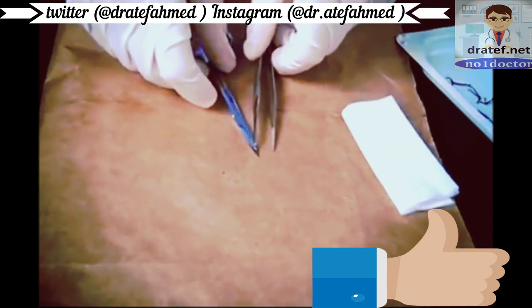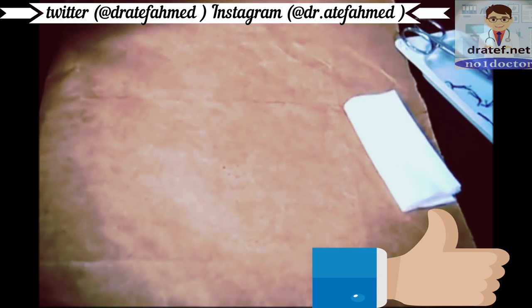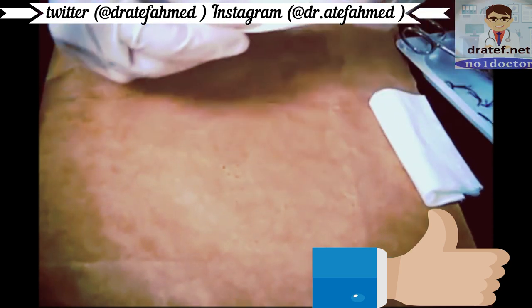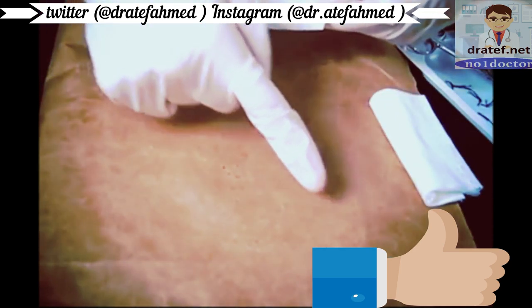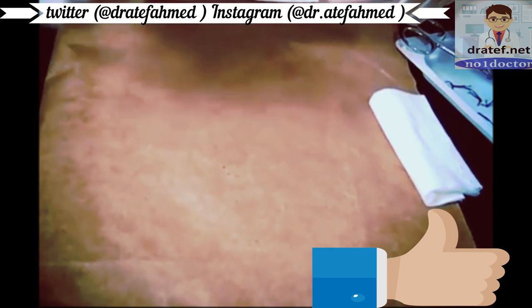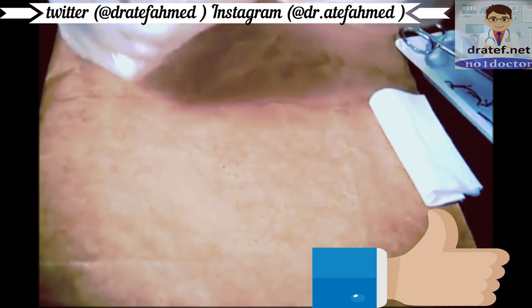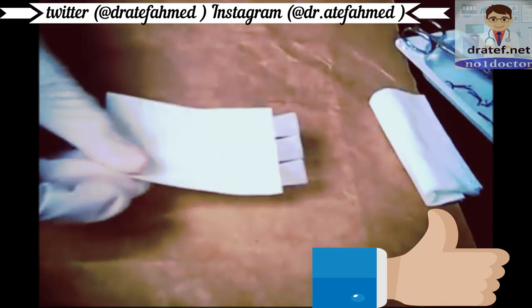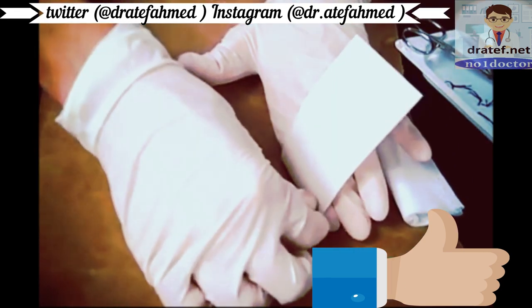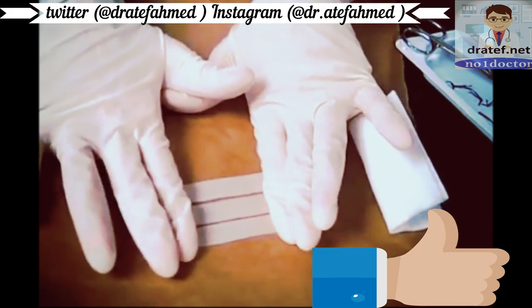That's it. After this, whatever the doctor orders — they usually order SteriStrips. Get your SteriStrips and I like to put skin prep around the outside; it looks like an alcohol swab and that just makes the strip stay a little bit better. Then lift the strip, make sure the incision is going to be in the middle, and go down like that.